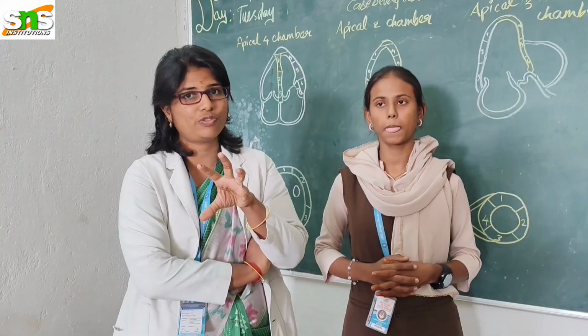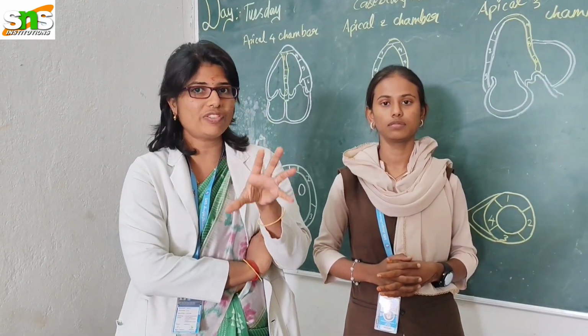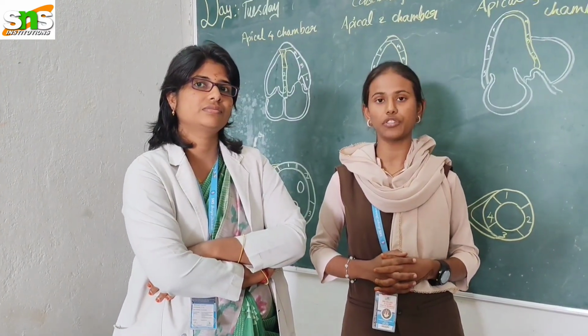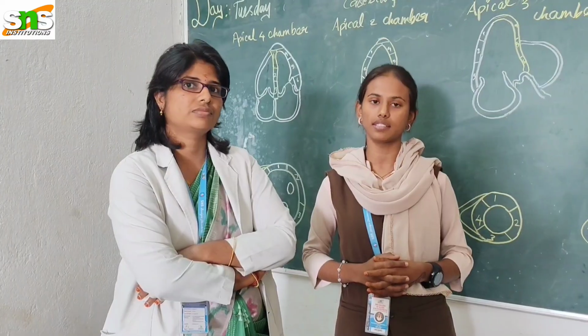So we want to focus more on regional wall motion abnormalities and global function of the LV, which identifies the mechanical complications of myocardial infarction, and it also assists us in prognostic assessment.